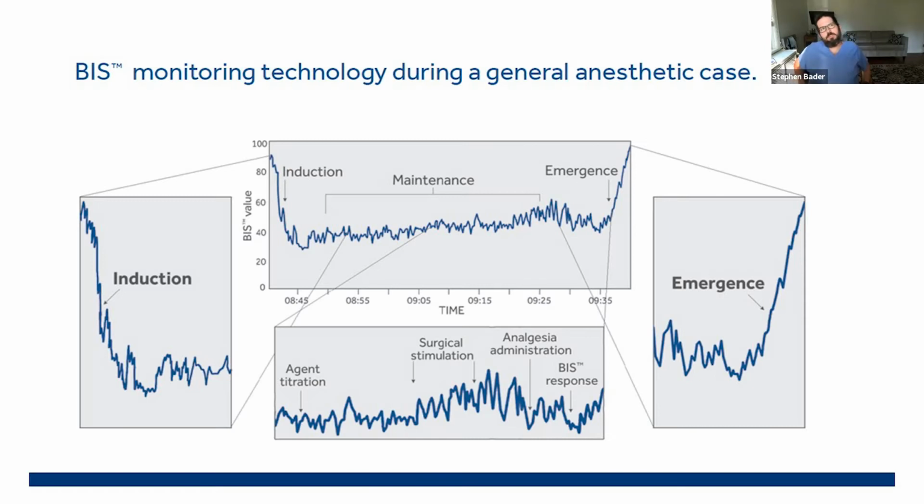Most clinical anesthesia people are going to think of the BIS as a way to help them maintain anesthesia, right? So the 3 phases of anesthesia being induction, maintenance, and emergence. Maintenance, the longest period of time during most general anesthetics, is where most of us think of using the device, because it can be a little boring monitoring someone during the maintenance phase of anesthesia.